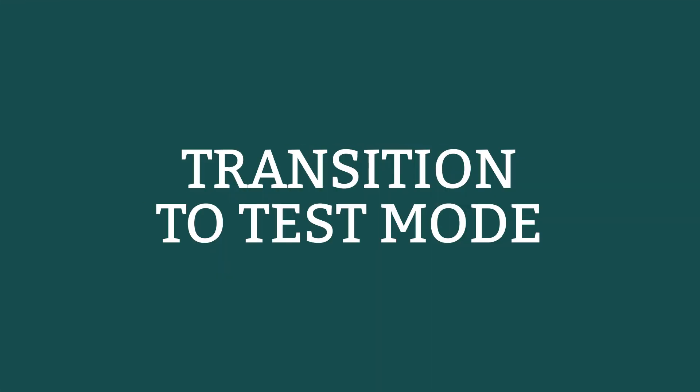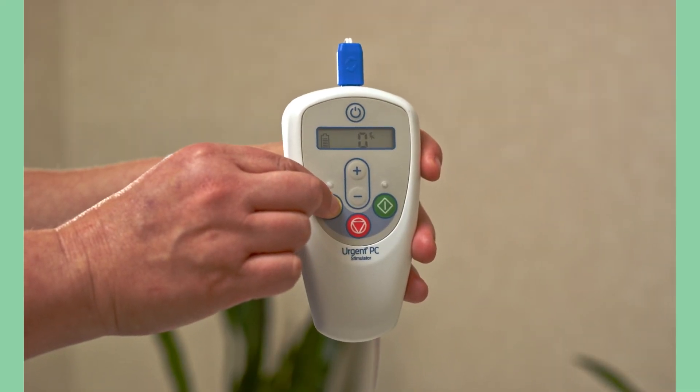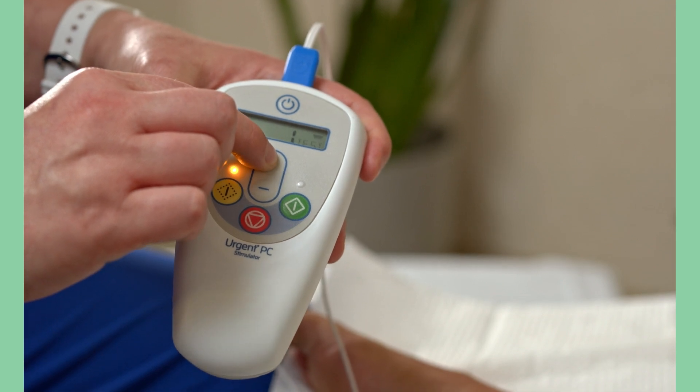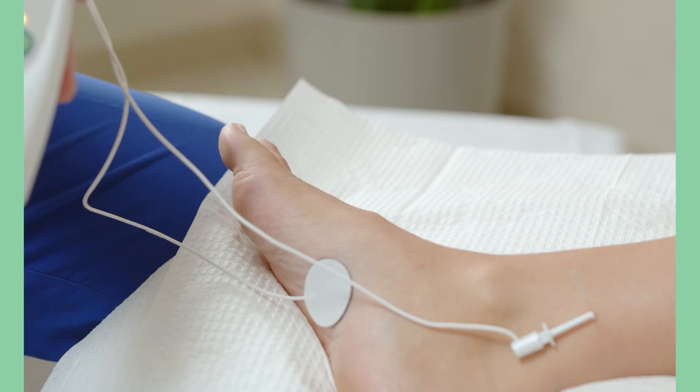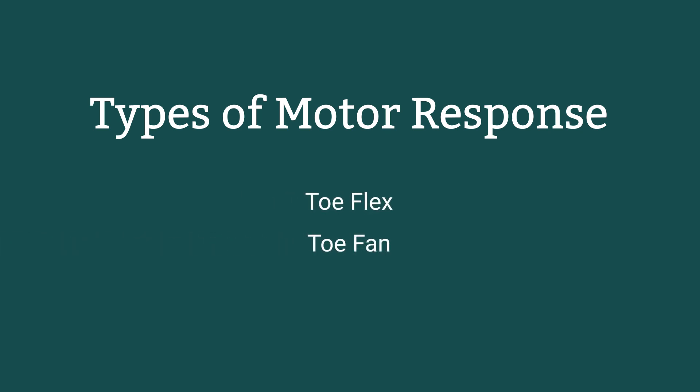If the sensation is localized to the immediate area around the insertion site, the needle electrode may need to be inserted further. At this point, transition to test mode by holding down the yellow test button for two seconds and adjust the current to see when the patient feels a response. Identify the treatment level using the plus button on the current adjustment. Slowly increase the setting while observing the patient's foot for a response and ask the patient to state any sensations they may be feeling. Motor response is usually a toe flex, toe fan, or toe twitch.